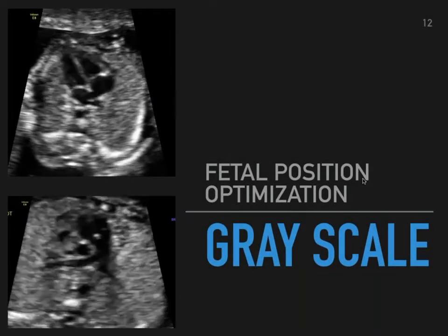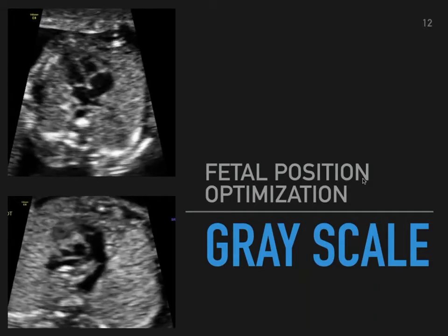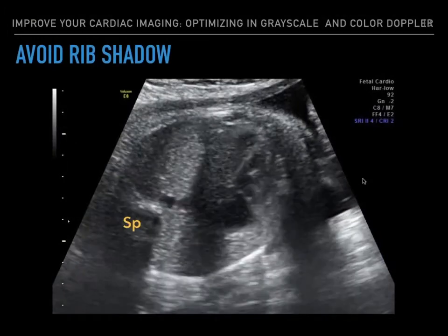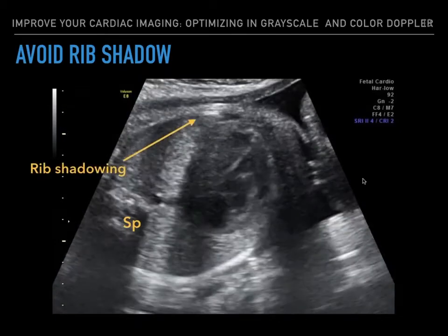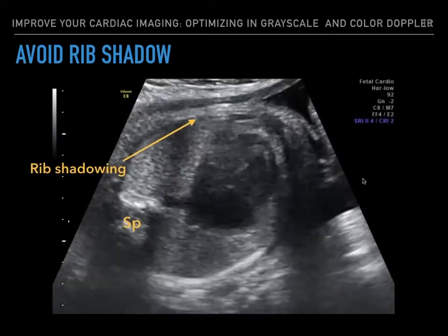Fetal position optimization in grayscale. One of the many challenges that we encounter is fetal positioning, especially with rib shadowing in the way, as you can see here. Now, how can we avoid this? How can we actually improve this image?